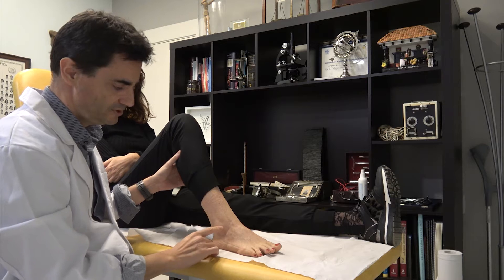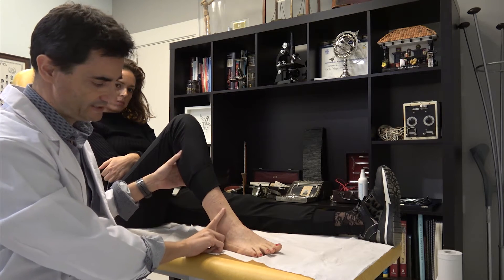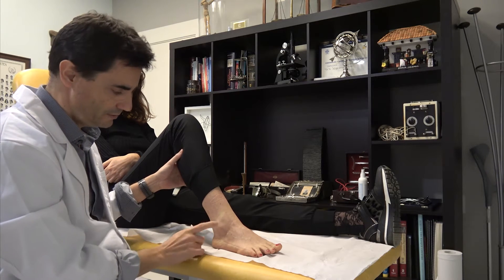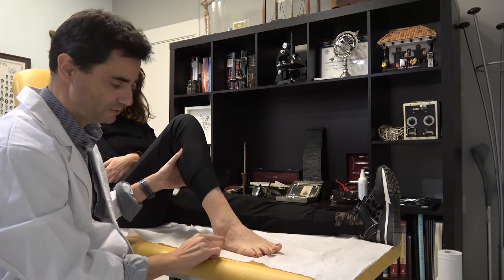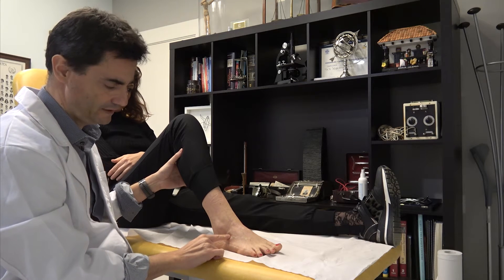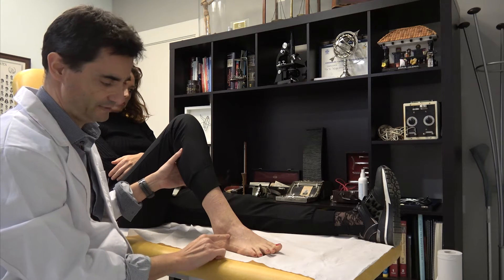In this position also, the anterior inferior tibiofibular ligament has this orientation — the second ligament we must search. The third one is the calcaneocuboid dorsal ligament, and the bifurcate ligament just above this ligament. This is the calcaneocuboid ligament and the bifurcate ligament here.